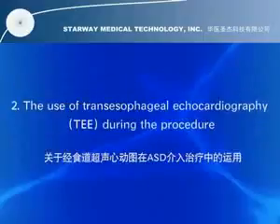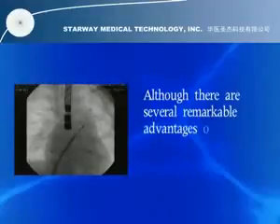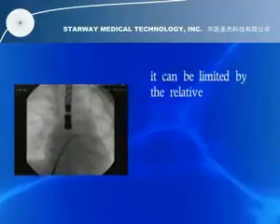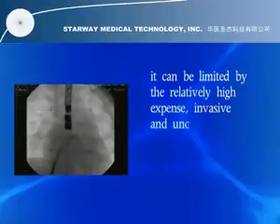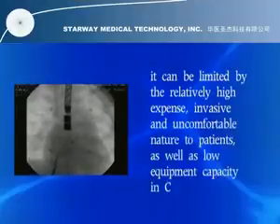The use of transesophageal echocardiography (TEE) during the procedure. Although there are several remarkable advantages of using TEE in the transcatheter closure of ASD, it can be limited by the relatively high expense, invasive and uncomfortable nature to patients, as well as low equipment capacity in China.